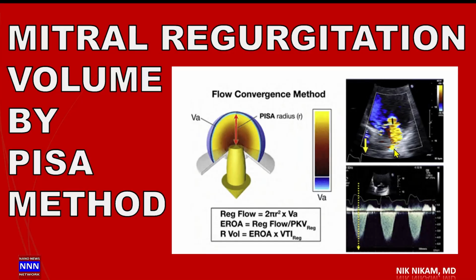As you can see in this 2D echocardiogram taken in a 4-chamber view with mitral regurgitation, we see two different things here. With a continuous wave Doppler, we see this very big regurgitant wave showing up, moving away from the transducer, which can be in the range from 4 to 6 meters per second, or 400 to 600 centimeters per second.